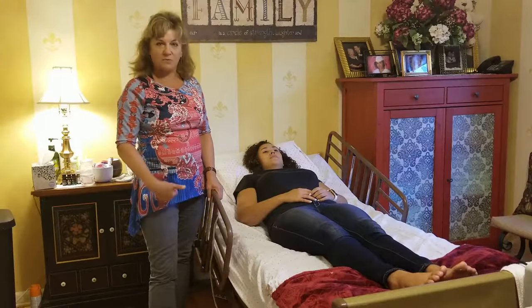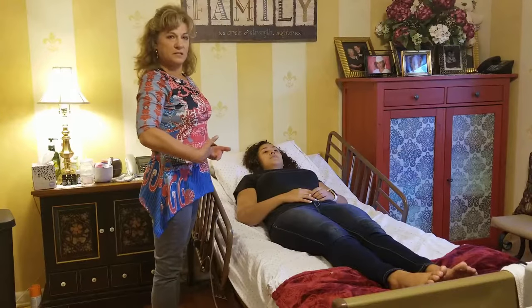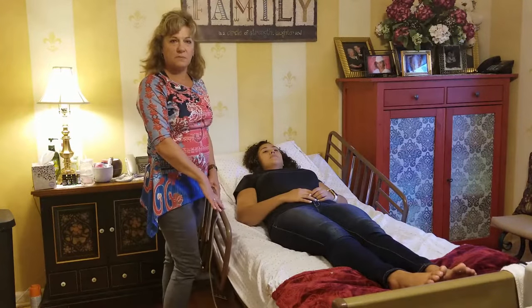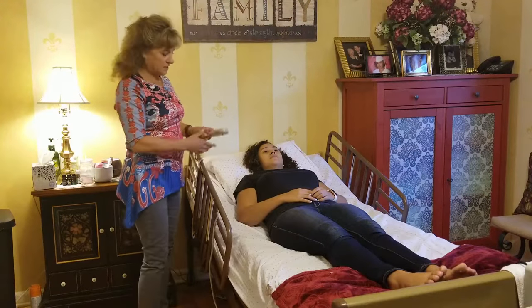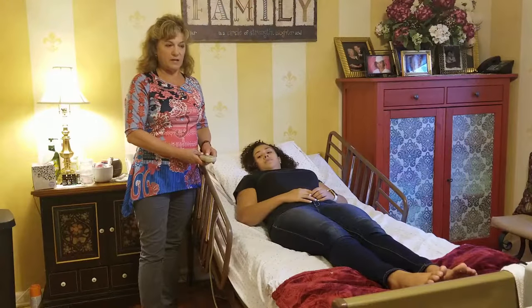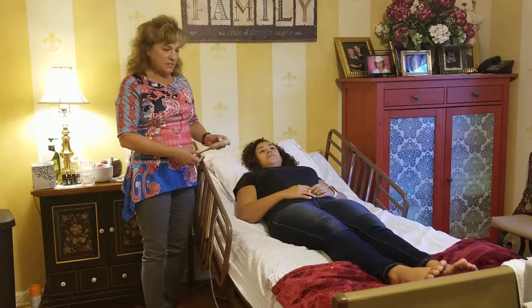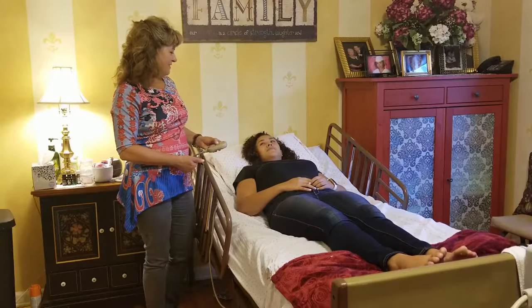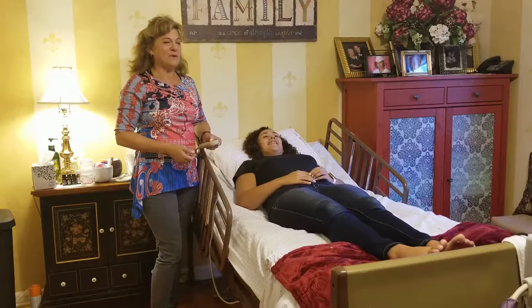The first thing I'm going to do is raise the bed, because you don't want to hurt your back. The bed should be up to about your waist so you're not bending over the person. Make sure the side rails are up so they don't fall out. Most beds have a remote — this is a hospital bed — and if you need one for mom or dad, get one with a doctor's order. Hit the button and take it all the way up.